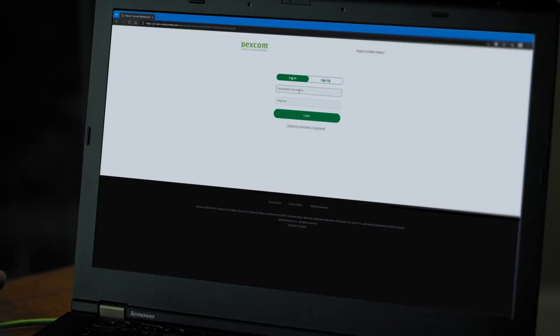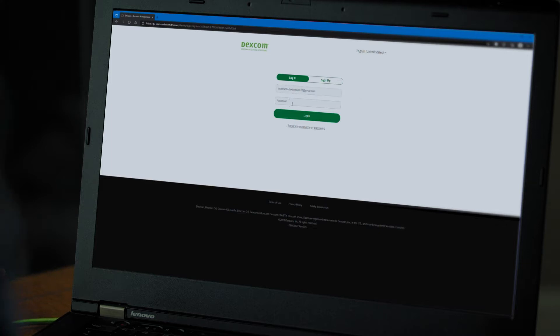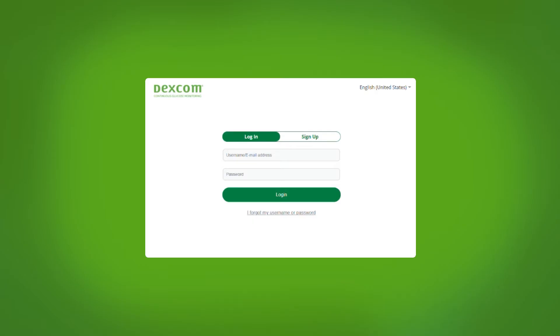If you already have a Dexcom account from using any of the Dexcom smartphone apps or websites, log in with that so your data is in the same place. If you've never created a Dexcom account, click sign up and follow the on-screen instructions.